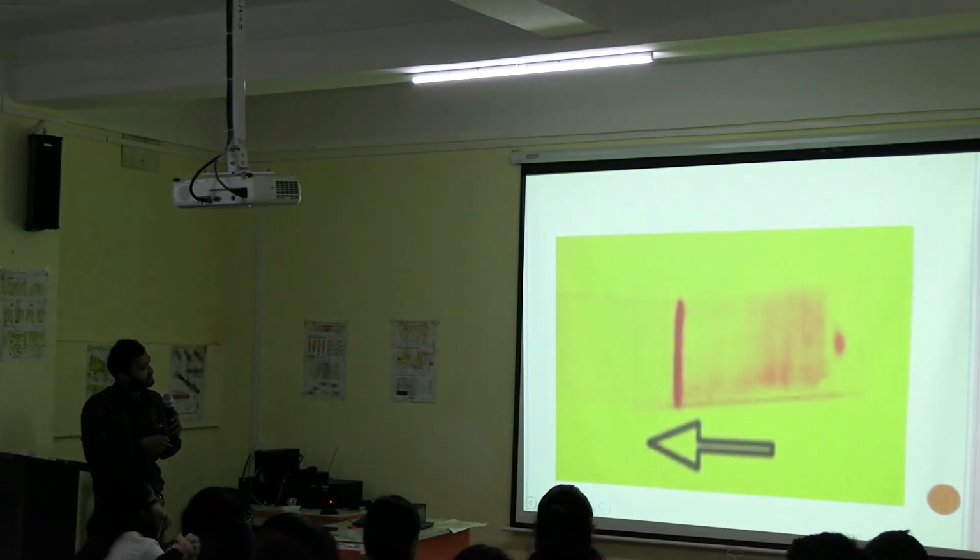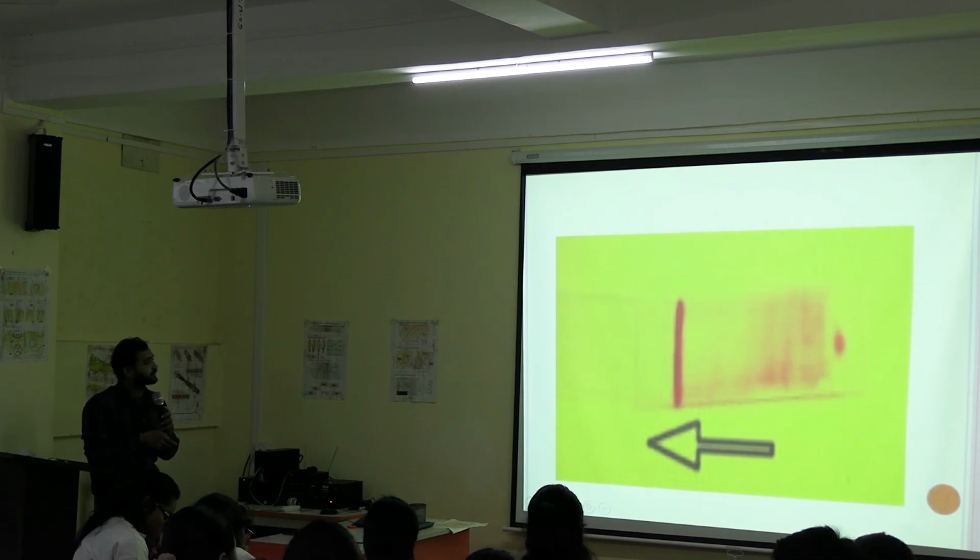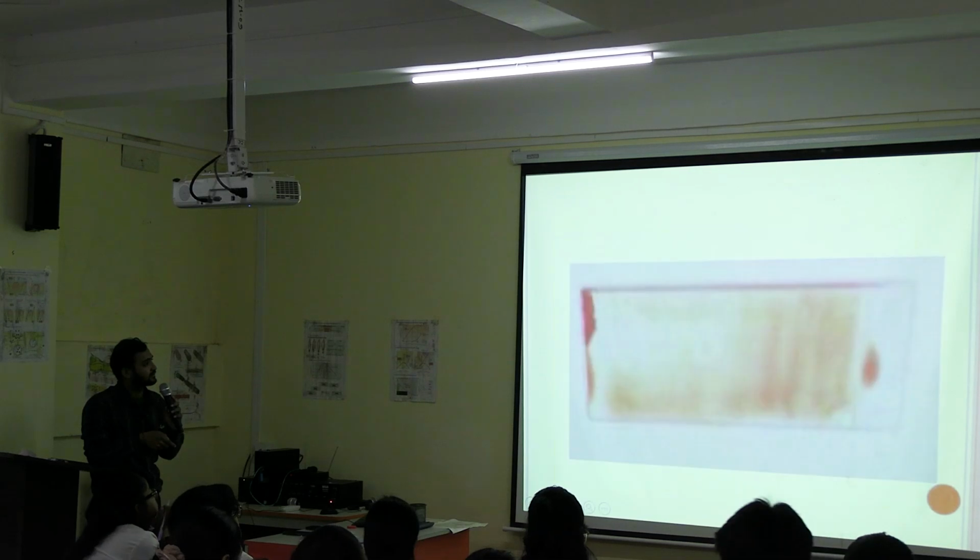So is this a proper smear? What is the shape here? Yes, striation. It has to be tongue shaped. For it to be tongue shaped, there must be a head, a body, and a tail. You have to notice this part. Many of you or your colleagues make mistakes in these steps. Everyone is following me? Any question you can ask.